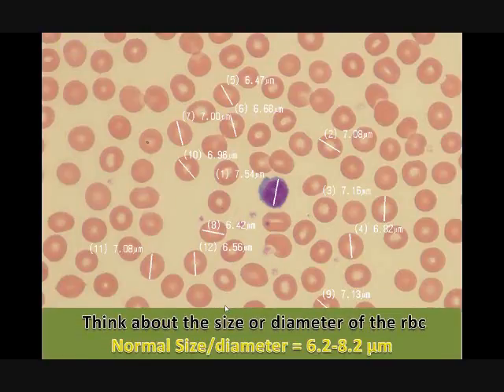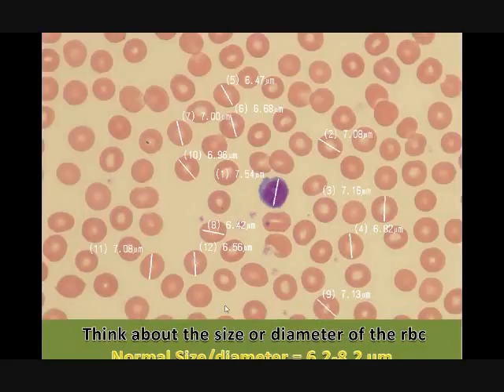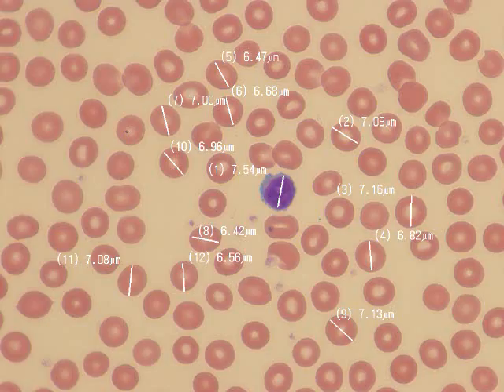A normal size is between 6.2 and 8.2, as we said, with an average of 7 microns. As you can see, all of the ones that we have measured fall between 6.2 and 8.2. So these would be considered normal size. You can also see that the ones that aren't measured are approximately the same size.